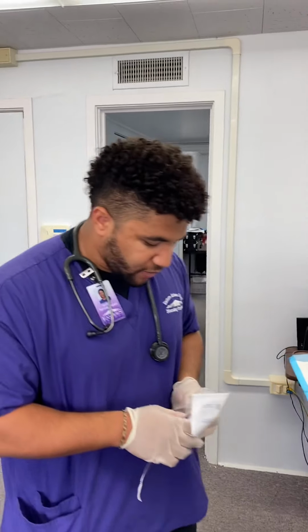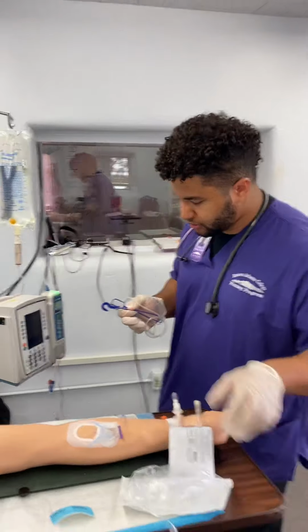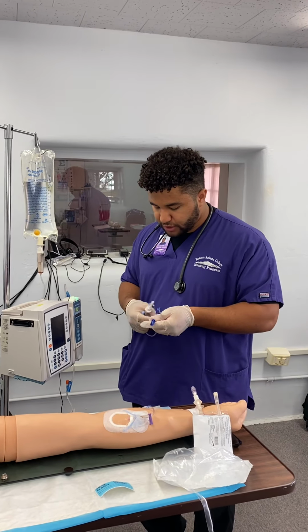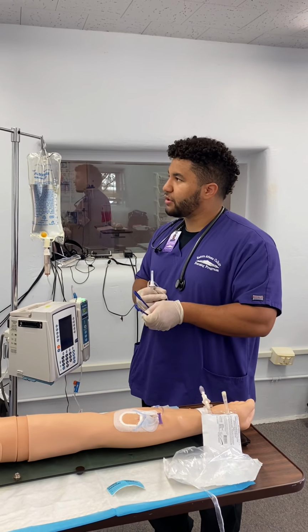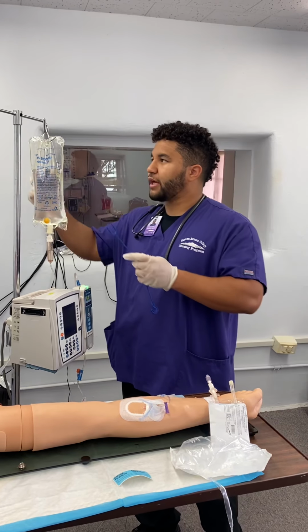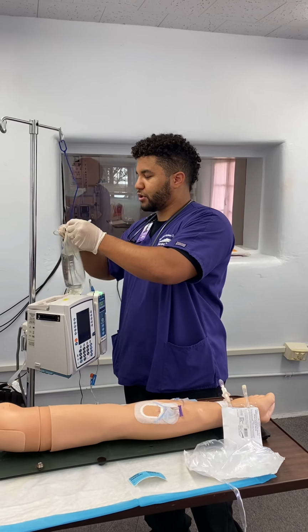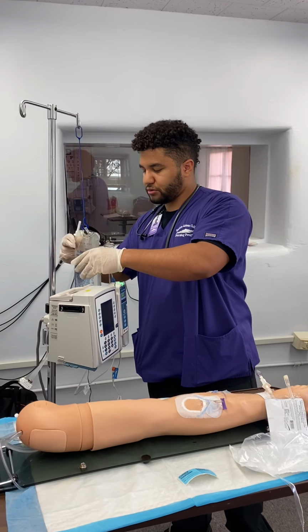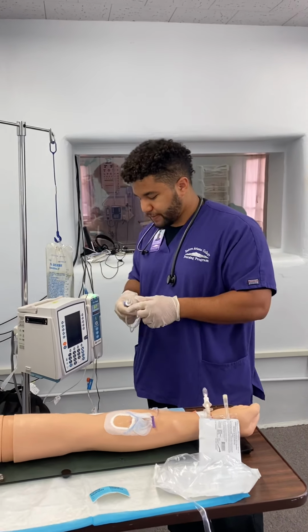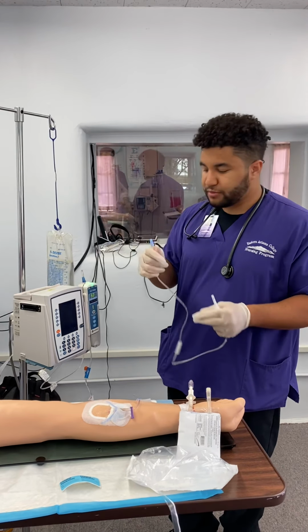You can then go ahead and open up your tubing for your secondary line. Now, to prime your tubing for the secondary line, you have to use your primary fluid so you don't waste any of your medication. Before we do that though, you can go ahead and drop your solution or else your piggyback won't work. So you need to lower your primary. Now, once you lower the primary, you can go ahead and start to prime your tubing.